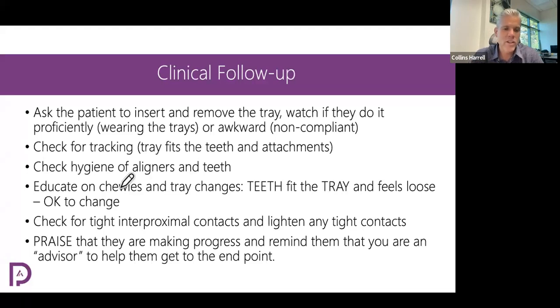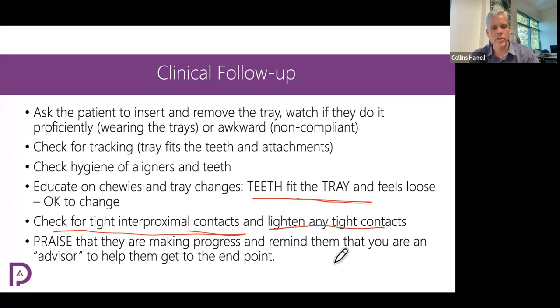So educate your patient on using the chewies. Make sure that the teeth fit the aligner and that the aligner doesn't feel tight before we change to the next one. Okay, so check for those tight interproximal contacts, lighten any interproximal contacts, clean out interproximal calculus. It's kind of like oiling the teeth so that they'll move easily, okay?